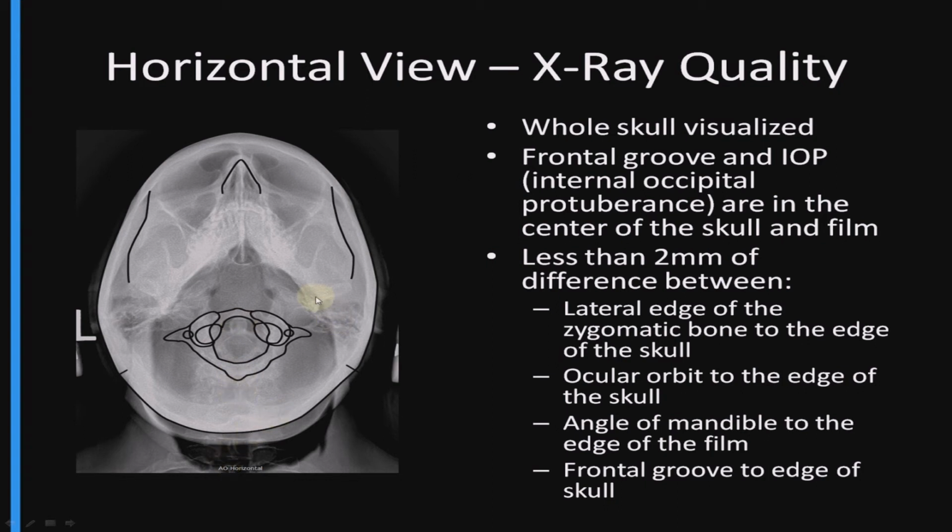One other little point of interest is that between the back of the mandible here and the occiput, there is a window through which we can most clearly see the atlas vertebrae. If the patient is not extended enough on the Bucky, then that window will close together. So the distance between the mandible and occiput will approximate, and it will close this window until the atlas starts to get superimposed by other bone sources. That makes it difficult to study. So if you're not able to see the atlas because of the other bone structures in the way, you need to extend the patient up onto the Bucky further. And that will open up your window to see the atlas.